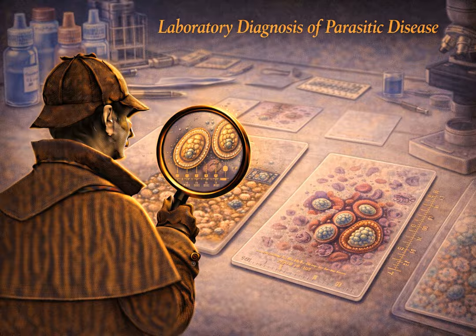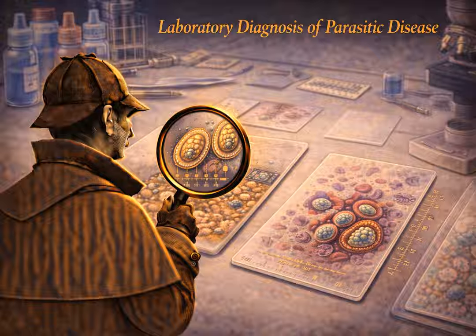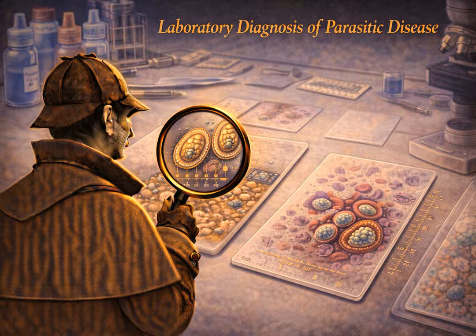The eggs are heavy and sticky. They don't just float freely in the urine pool. They often settle and get densely trapped in the mucus and inflammatory pus right at the base of the bladder trigone. They are really only expelled efficiently at the very, very end of urination, as the bladder muscle squeezes down tight. So you must explicitly instruct the patient to collect the very last few drops of voided urine. So definitely not the clean catch midstream sample we always use for bacterial UTIs. Exactly the opposite. You want the terminal urine.